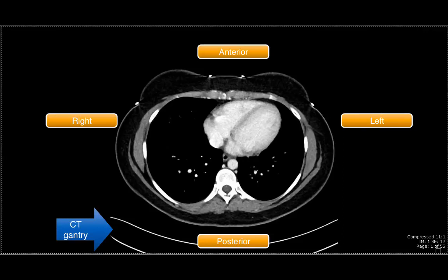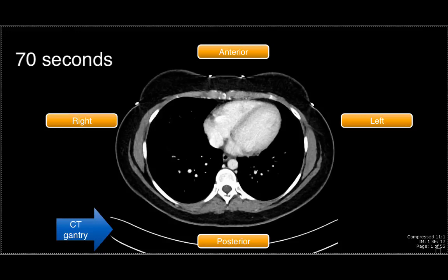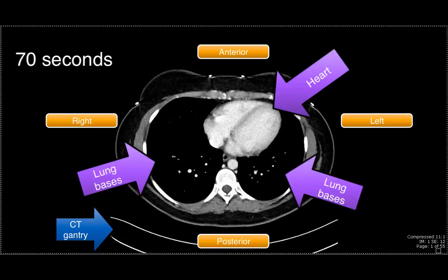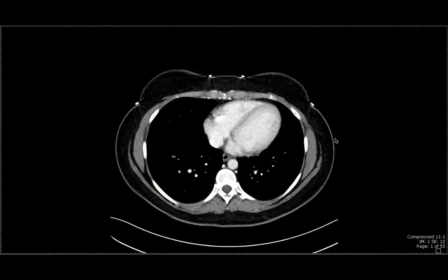There are two additional things to point out before we go through the organs. Firstly, most abdominal CT scans, including the one shown here, are performed at about 70 seconds after giving intravenous contrast. It's important to appreciate that sometimes we image earlier if we're interested in the arteries, and sometimes a little bit later if we're interested in certain specific pathology. Secondly, we also include a portion of the lung bases and the heart to ensure we image the entire supermost aspect of the abdominal organs. As we scroll through these images, we're going to be scrolling caudally, that is, towards the feet of the patient.